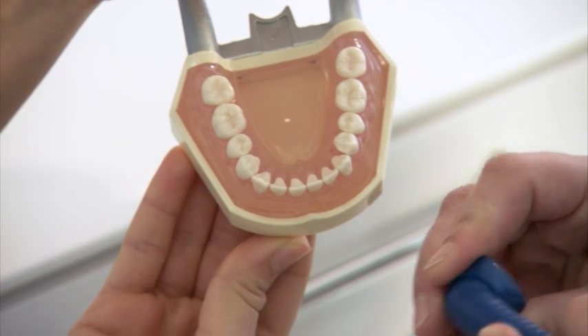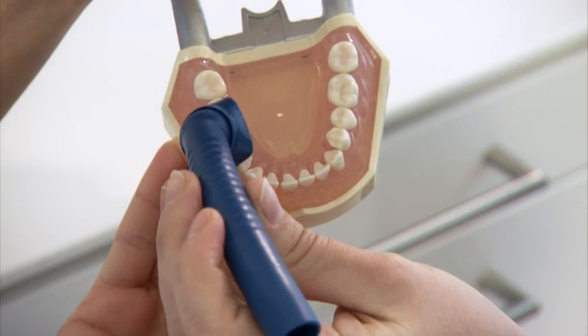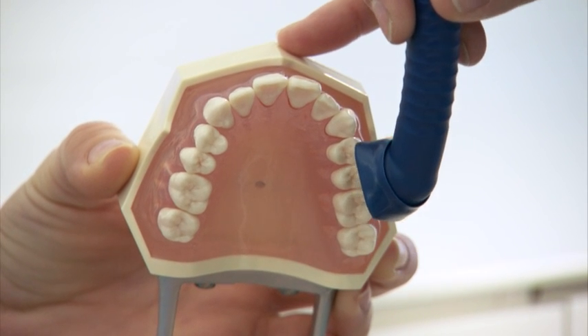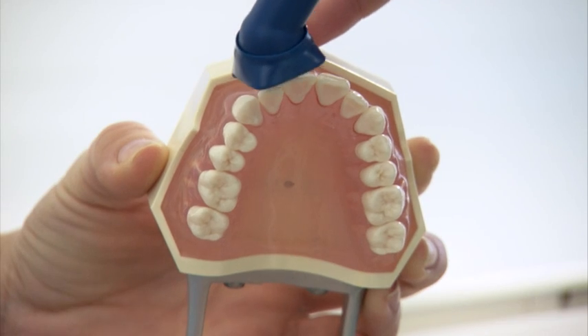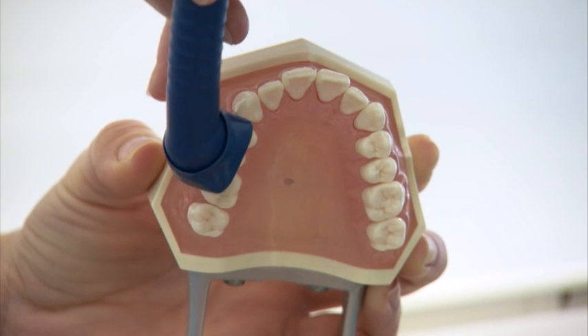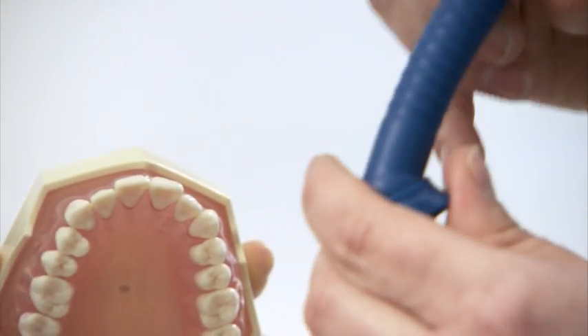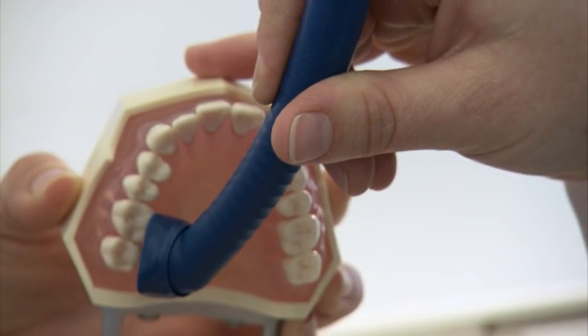When switching quadrants, the shield is relocated to the appropriate suction position to again ensure effective suction. The distinct side of the Prophylaxis cannula shield is also oriented and set towards the gingiva for treatment within the upper jaw. The flexibility of the shield again provides for an optimal suction position from buccal to palatal.